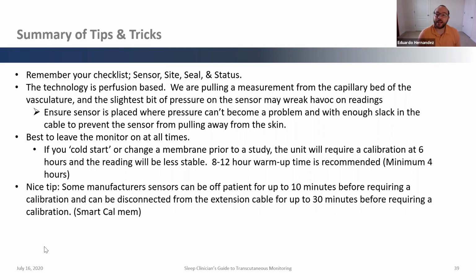It's also important, a little tip and trick that I've personally seen. I couldn't believe this until we did it. I was kind of skeptical. You leave the transcutaneous monitors on. You don't turn them on and off with each patient use. If you leave them on, it will actually use less calibration gas, and you'll have to calibrate your membrane, or your sensor, less, which means it's less use, less calibration. So it's just like a car running, right? It uses more gas upon initiation, and then once you're coasting, it uses less gas. That's the kind of idea behind that.